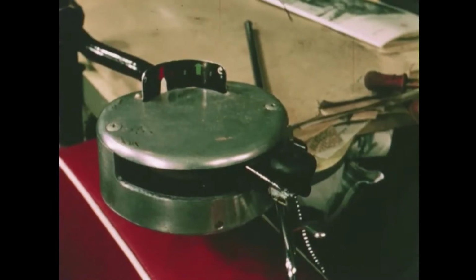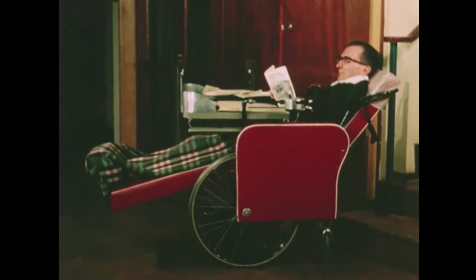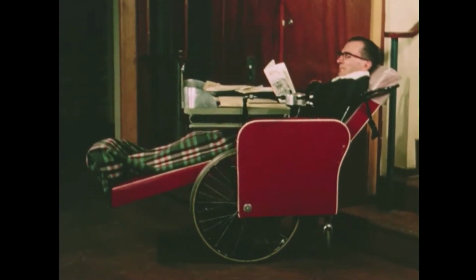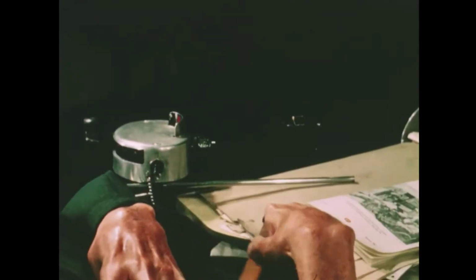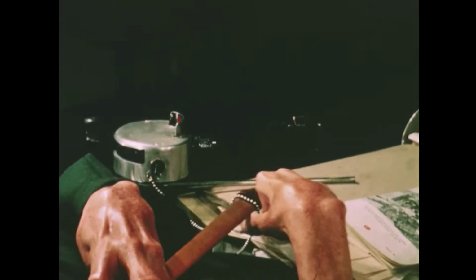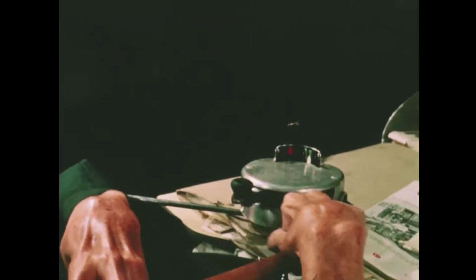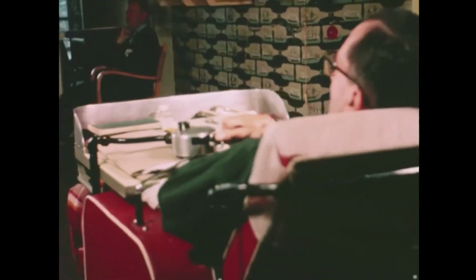Green for forwards, red for reverse. A desk tray fitted with a reversing mirror completed the ensemble. Frank reads a booklet in his new electric wheelchair with its table attachment. The control box is on an arm, which folds out of the way when Frank isn't driving. A switch turns the engines on. Frank unfolds the arm and pulls the control box towards himself, using a chain attachment. He moves off in the new wheelchair.